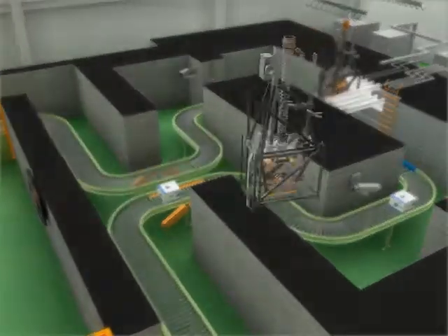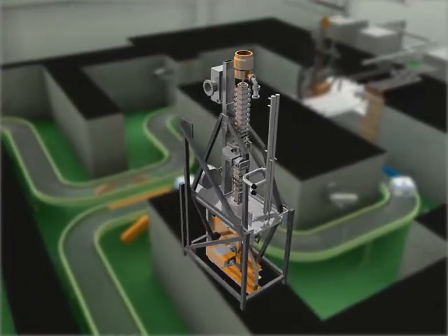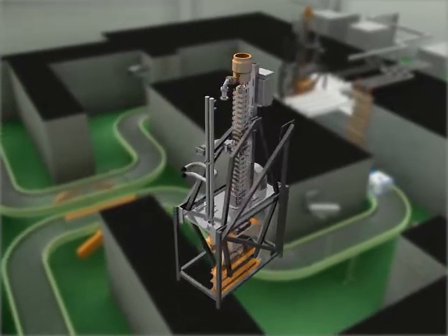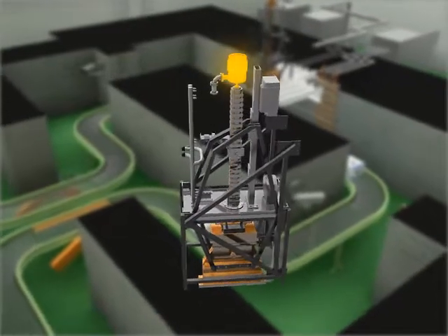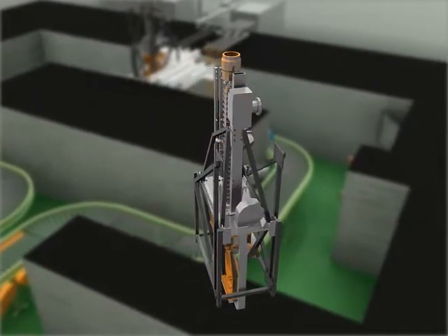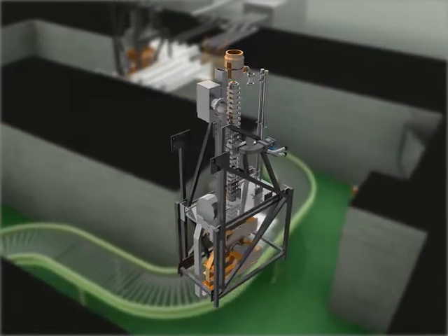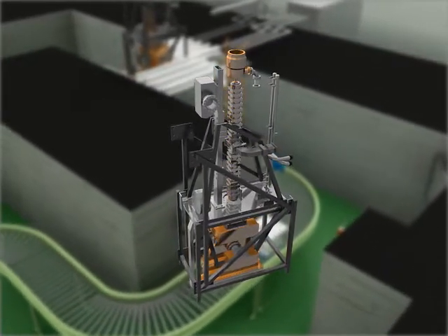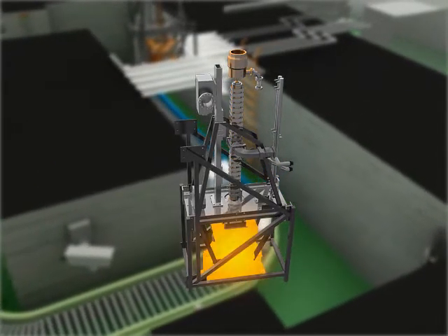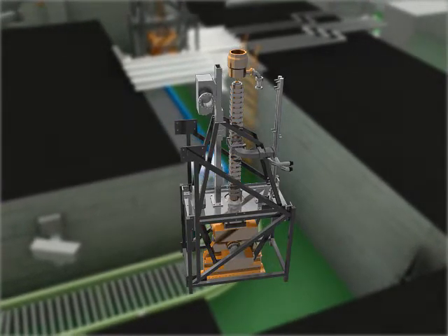What you are seeing now is a 10 mega electron volt linear electron accelerator operated by Giga Electron Volt. This accelerator, manufactured by Mevex in Canada, creates thermal electrons in the cathode and emits them into a cylindrical cavity called an accelerating waveguide. Here, RF electromagnetic waves in the S-band domain are formed, which accelerate the electrons up to 10 mega electron volt energies through the scanner. A bunch of electron beams spread and are diverted over the products.